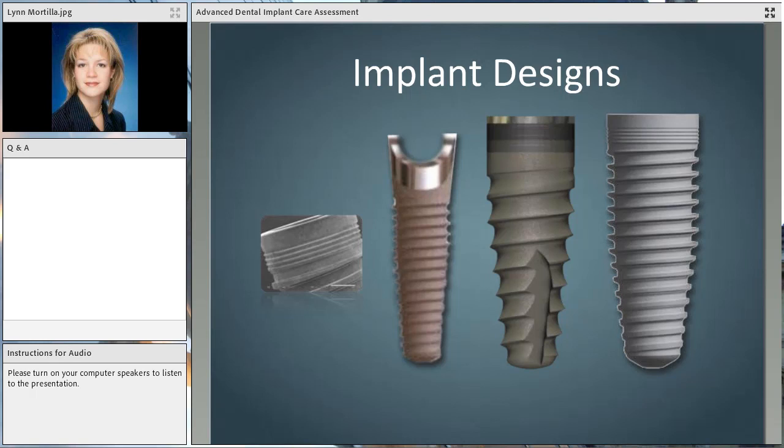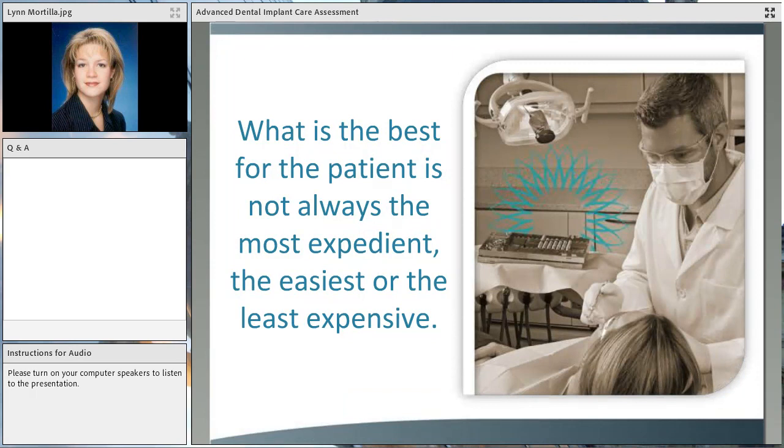What focus has come about recently over the past 5 or 6 years and is continuing with a lot of fury right now is, what is the optimum implant design to enhance crestal bone health and sculpt gingival tissue with the prosthetics to be very aesthetically pleasing. So this design right at the crest of the implant is what a lot of attention is focused on, and it's what a lot of the implant manufacturers are jockeying to find the best and create the best for us to use in our patients.